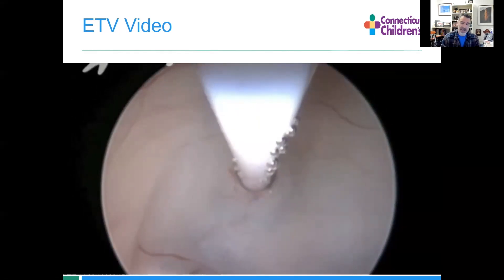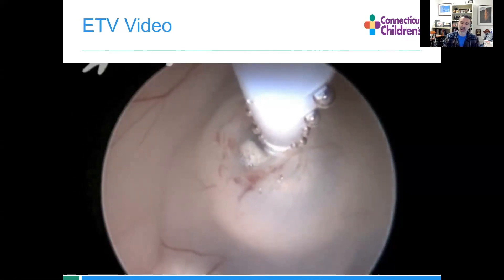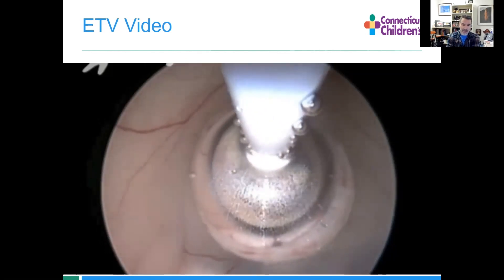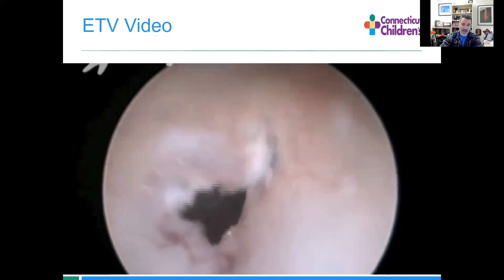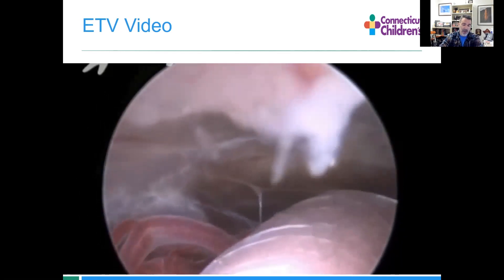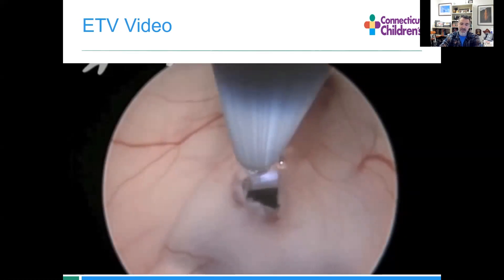There are a lot of schools of thought in terms of how best to do this. Some people like to dilate the hole; they're concerned that if you put traction back, you can grab a perforating vessel — always bad form. But it's what I do and I've never had a problem personally. We go down through and take a look — there's big red right there. That's the basilar artery and the perforators; probably leave those alone. This operation is very effective at treating obstructive hydrocephalus.